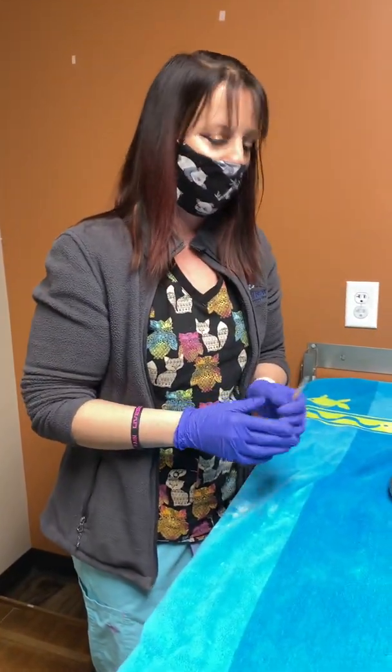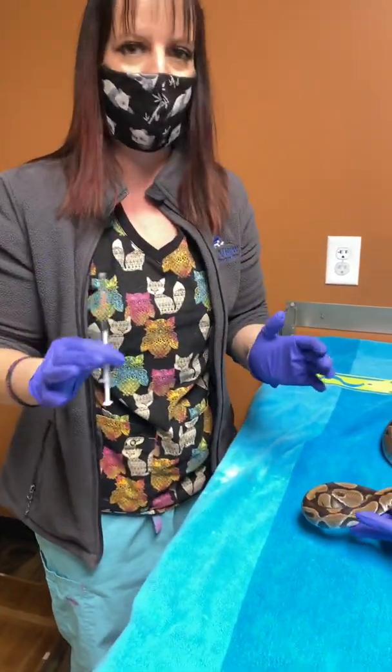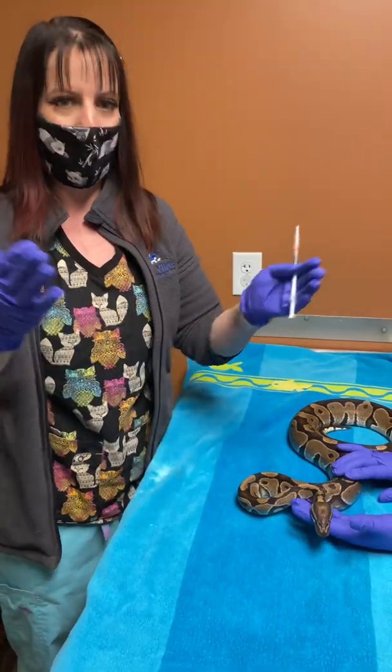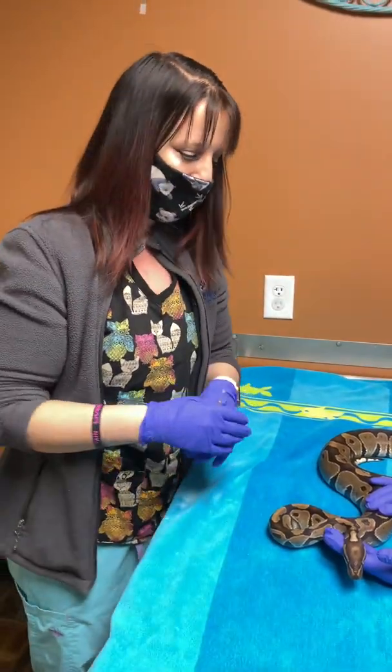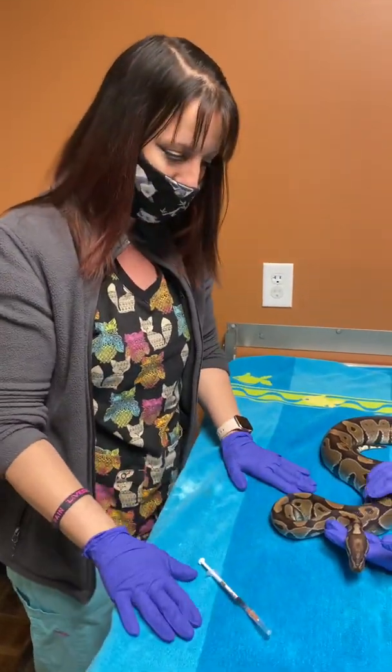Hi, today we are going to go over how to give your snake an IM or intramuscular injection. Your vet prescribed medication and said that you need to do an injection, so we want to ease into it so you feel comfortable giving your snake or reptile an injection.